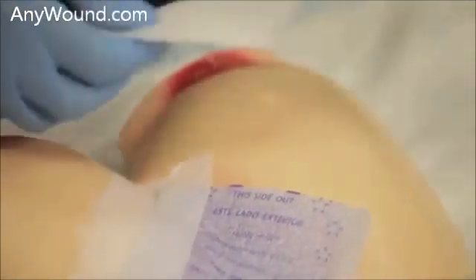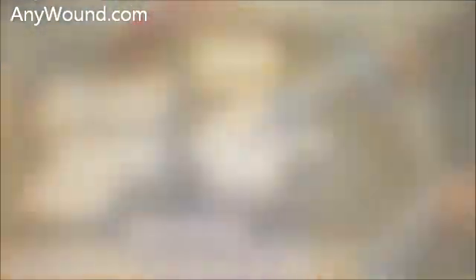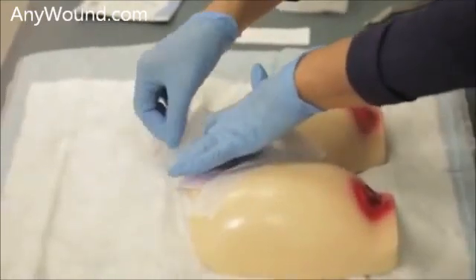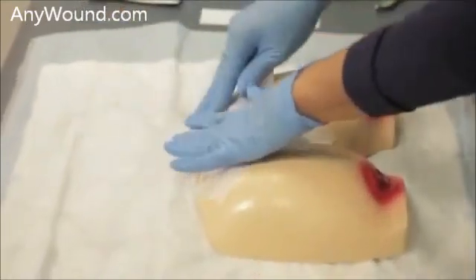We'll secure this other border, and then we'll secure this edge of the dressing, and now we're going to secure this last edge.